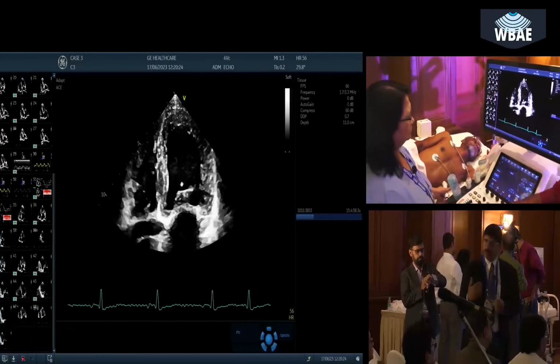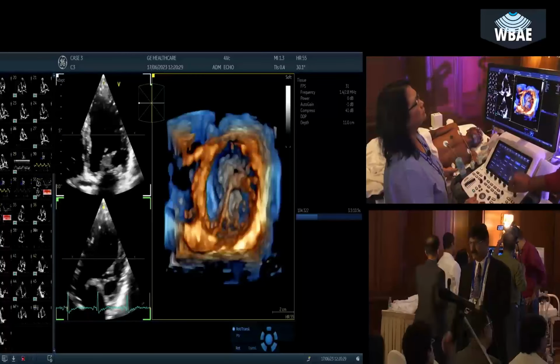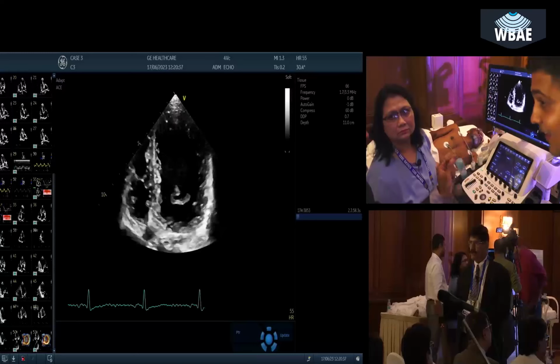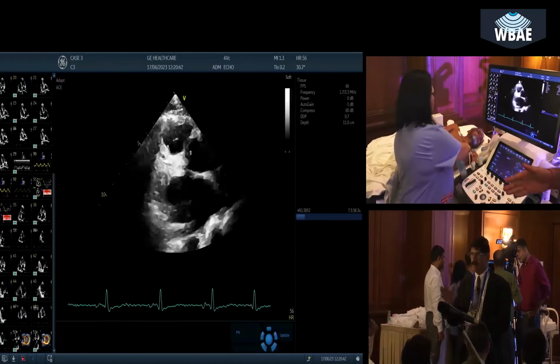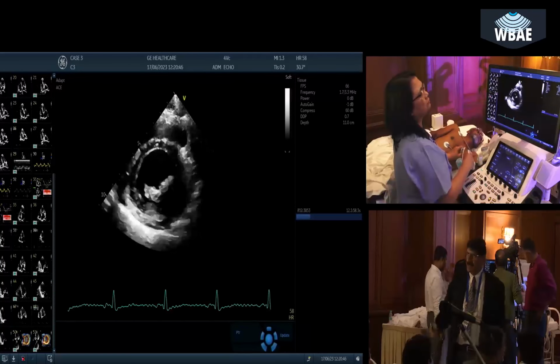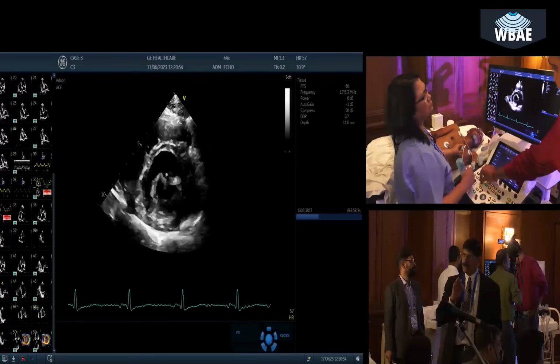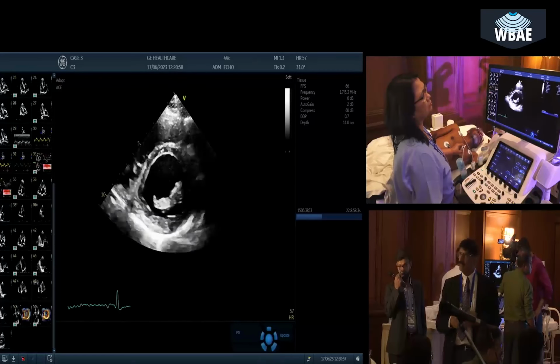So what we do quite often, me and Dr. Madhu, we shoot contrast in everybody where ejection fraction is critical. Critical means you want to decide whether ICD or CRT should be given, or whether the patient is showing improvement, or we are part of a study. We will never report ejection fraction like this. This has a variation: I could report 50%, you could report 60%. But if you trace the endocardial border, which comes so beautifully with contrast, there is no chance of making a mistake. Foreshortening can still occur.